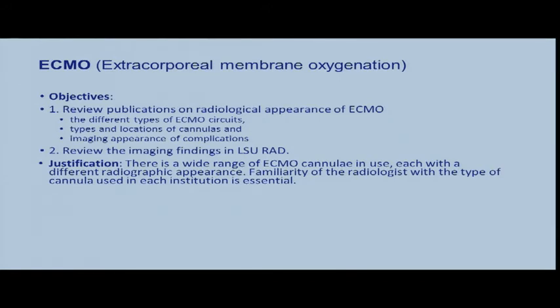This afternoon, I'll be discussing the role of radiology in management of ECMO devices. Basically, my objectives will include to review the publications on radiological appearance of ECMO, the different types of ECMO circuits that we have, the types and locations of the cannula, which is what we usually assess for the critical care doctors, and also the imaging appearance of complications that may arise from the use of ECMO. I'll also be reviewing the imaging findings in LSU Radiology here.